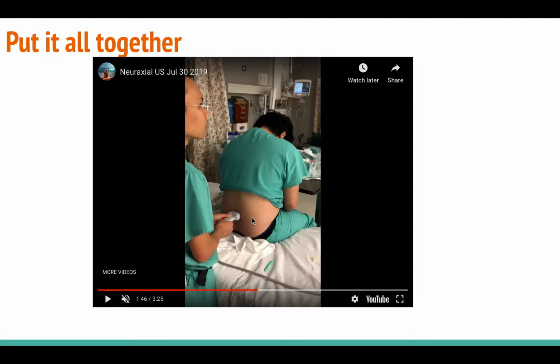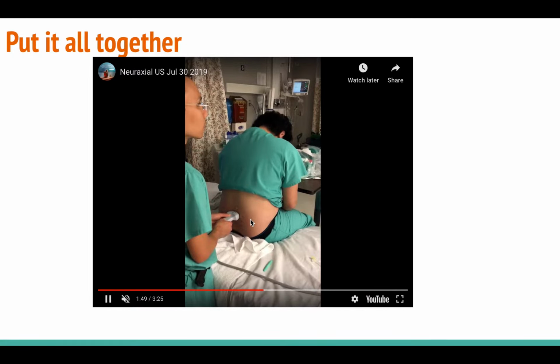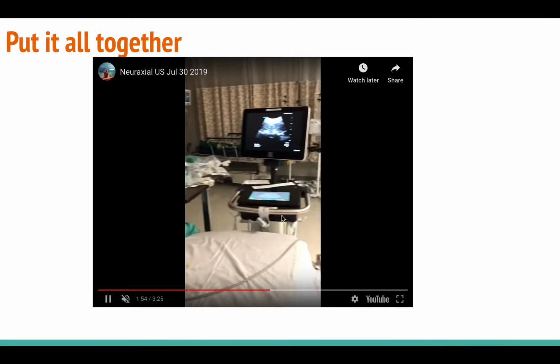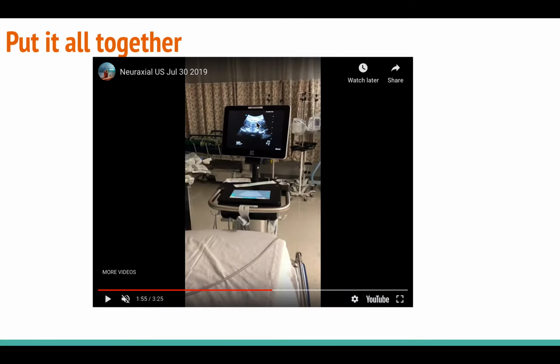But sometimes the patient moves for various reasons. You turn the transducer 90 degrees and you're looking at the spinous process. If that's the case, then just slide up and down and try to find the interspace. Some tilting may help as well. And here, I'm trying to look for my bat wing sign. That's my bat wing sign. Up here is my posterior complex. It correlates to about the same 5 centimeters. Here's my articular process, transverse process, anterior complex.